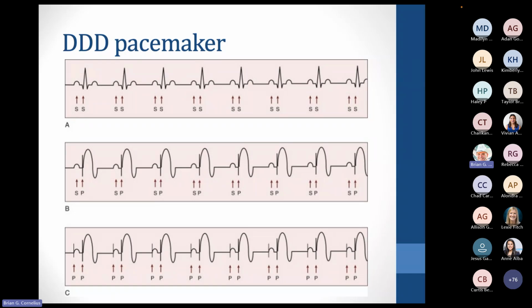Part of that just lets you know how sick your patient is. Sometimes you'll see patients who just have ventricular pacemakers and there's no atrial activity at all. So you have to keep in mind that they've lost a pretty significant amount of their cardiac output by not having that atrial component. They're also at a little bit of an increased risk for emboli because the atria is not contracting effectively.